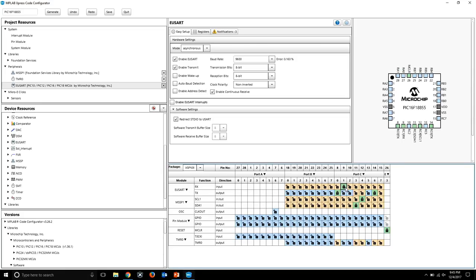For me. And you can see the TX on RC6 is actually selected by default, which for our application we don't need. But once again, that's a row that has blue lines, so we can actually select multiple pins simultaneously. For our case, we're not going to do it. But in your case, maybe your application might need that, and you can just select it. All right. So I'm just going to unselect that.